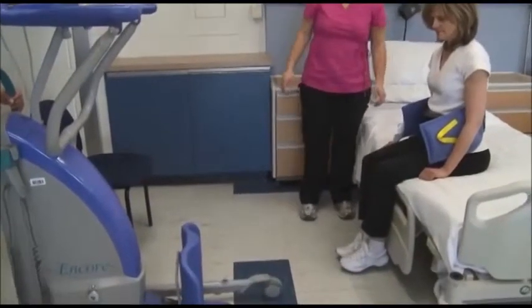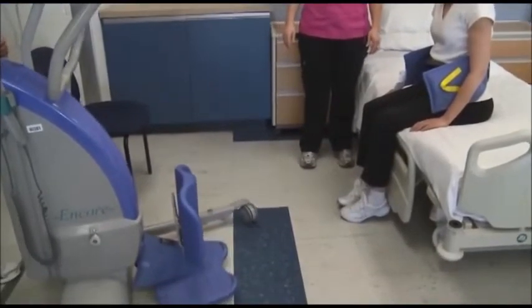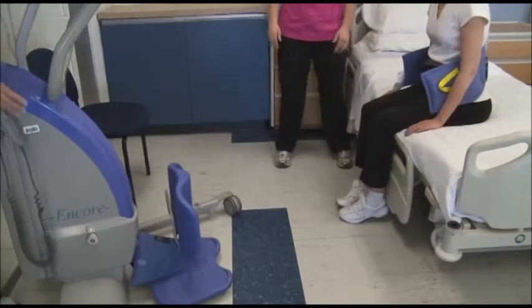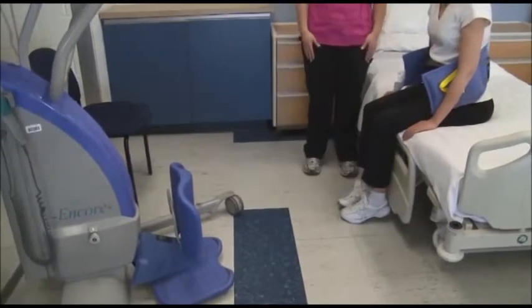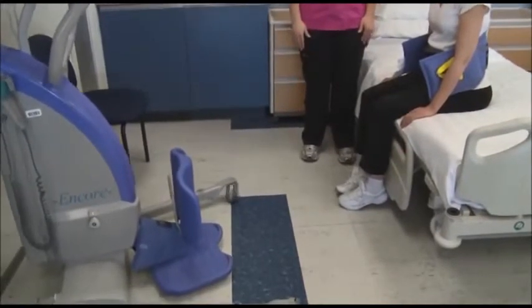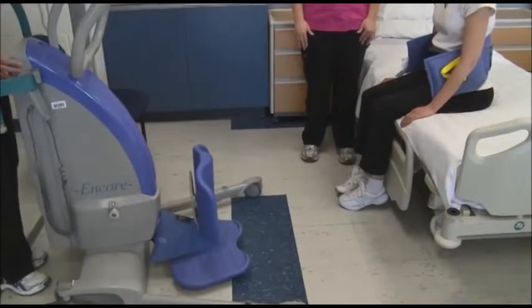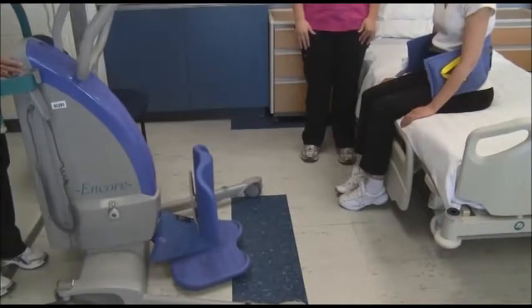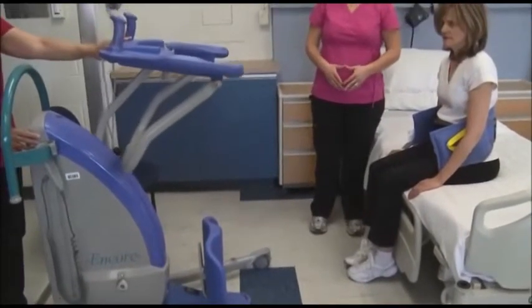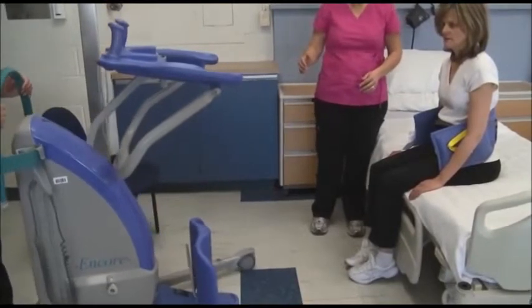first widening the legs at the bottom of the lift. And one way to use this lift is to make sure that one of the legs is on one side of the bed caster and the other is on the other side. Okay? I'm going to lower the handrail as well. And now I'm going to actually move the lift into my client.